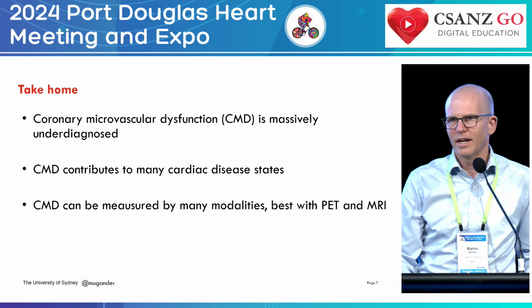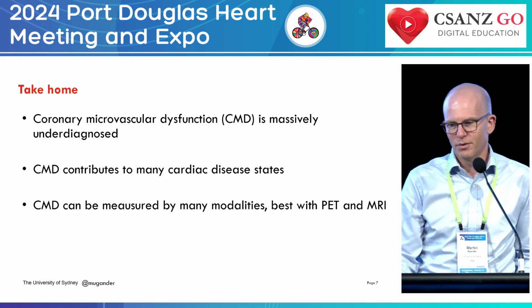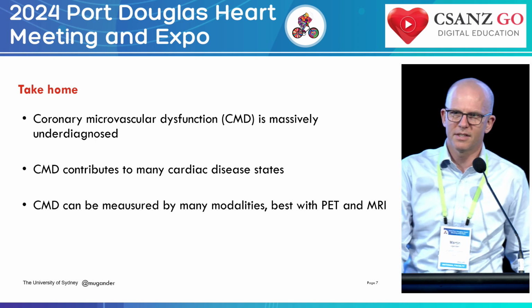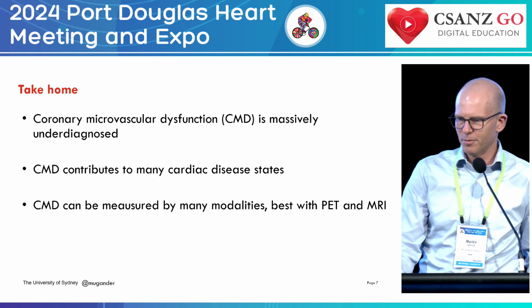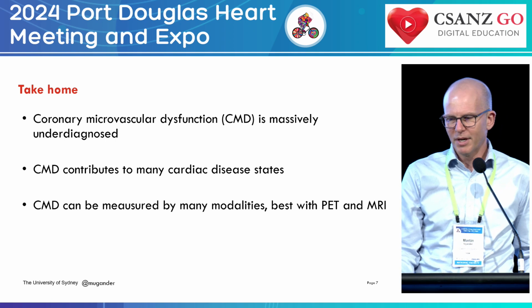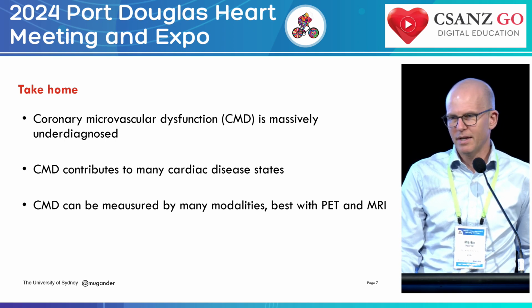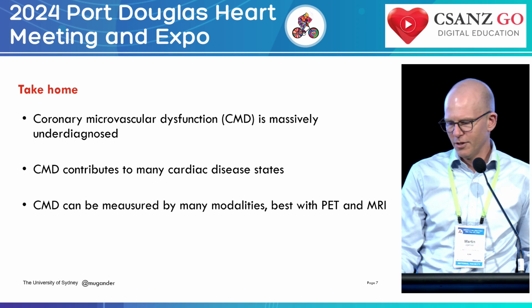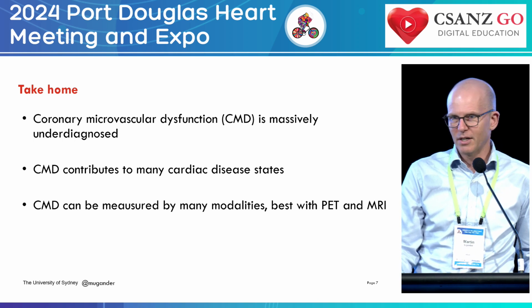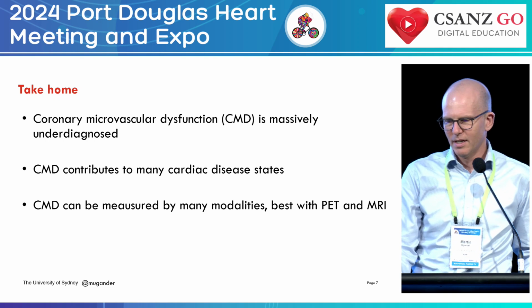So it's being underdiagnosed, so there's an opportunity to diagnose it non-invasively. It contributes to many cardiac disease states, not only in the coronary spectrum, but in other aspects of the cardiomyopathies, but it can be measured by many non-invasive modalities, and both PET and cardiac MRI can do it excellently. So reach out to a center near you and ask them if that's a possibility.